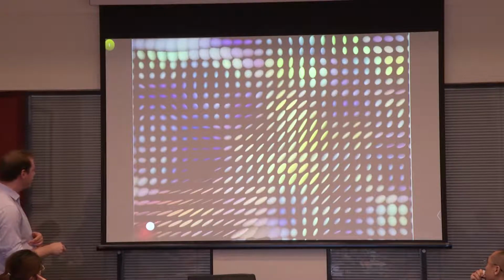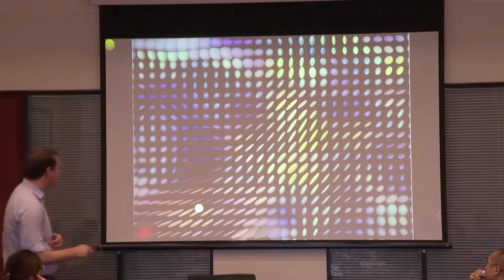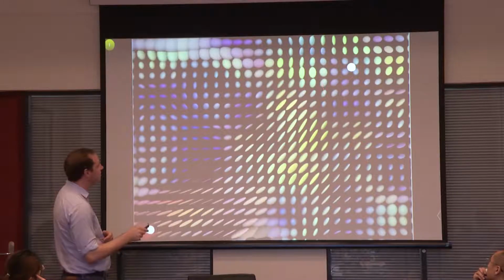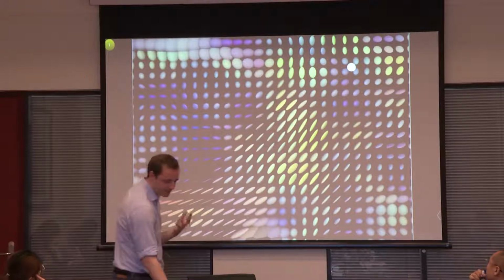We always look at which direction it goes, and we basically move through the tissue and record this, and we get a streamline track. And here we stop maybe because there's more water and it's not clear where to go, so we stop. And so that's a basic concept.